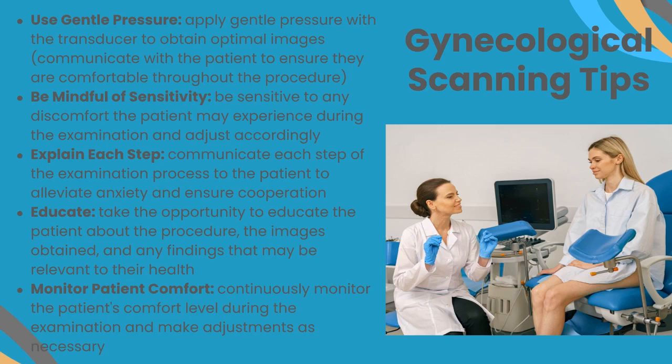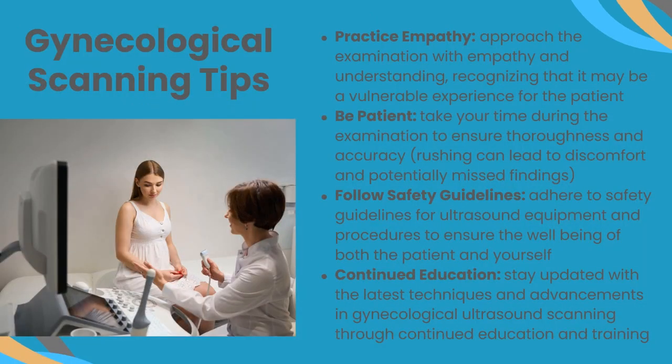Explain each step, communicate each step of the examination process. Educate the patient on what you'll be looking for, what the images are going to show, any findings that may be relevant to their health, the comfort level of the patient, and make adjustments if necessary. Approach the examination with empathy and understanding, recognizing that it may be a vulnerable experience for the patient. Be patient, take your time during the examination to ensure thoroughness and accuracy. Rushing can lead to discomfort and potentially missed findings.